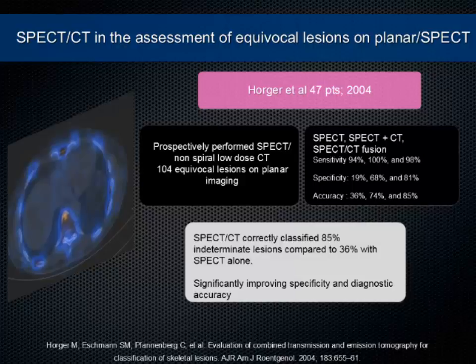But somewhere in 2005, the first of the software technologies like the hybrid camera came in from GE as a single slice Hawkeye camera, but later on people developed multi-slice CT, and at present we can have very good CT component studies.